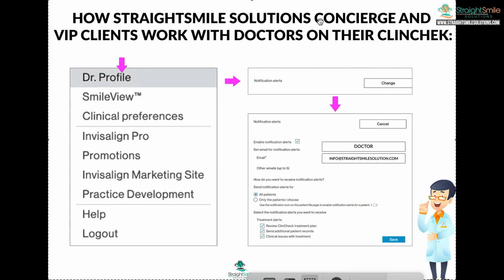Always submit all cases as comprehensive cases. We can always downgrade them if we need to. But if you submit them as an express or a limited, you will be limited in your outcomes. And I like to just have one set price for Invisalign. I don't like it when people have two different prices because things don't always go as predicted. I mean, very rarely is it ever going to just be a 5 or 10 aligner case. It doesn't work that way.